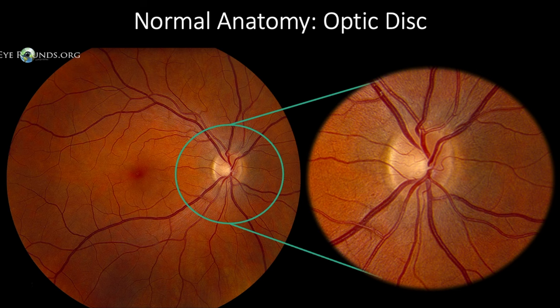Within the disc there should be a physiological cup. Although quite variable, the cup is typically less than 0.6 times the diameter of the disc. This comparison in size is referred to as the cup-to-disc ratio, which can be measured by dividing the vertical height of the cup over the vertical height of the disc. In this case our cup-to-disc ratio is approximately 0.4.